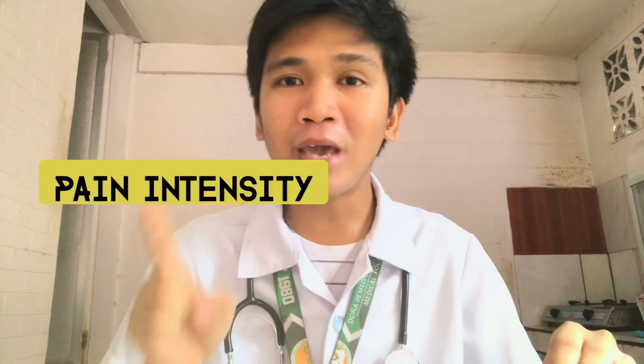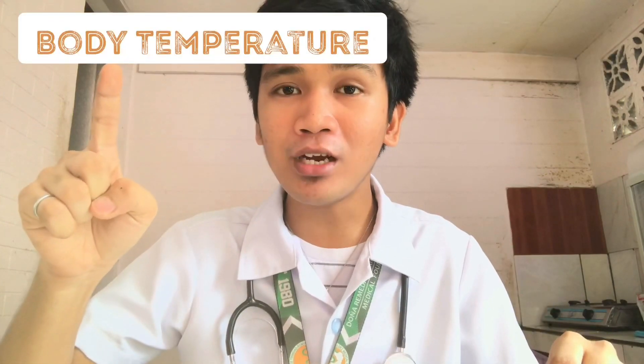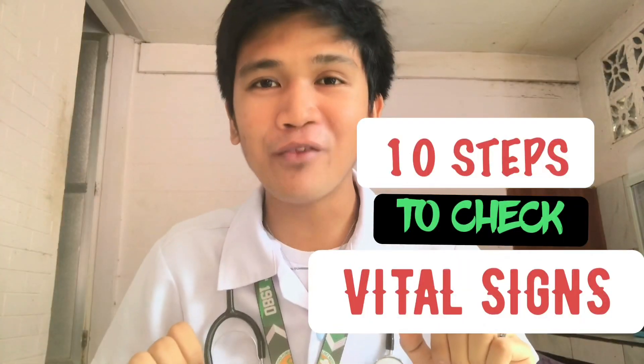Do you want to learn how to check blood pressure, heart rate, respiratory rate, pain intensity, and body temperature? Because today, I will be teaching you 10 steps on how to check vital signs.